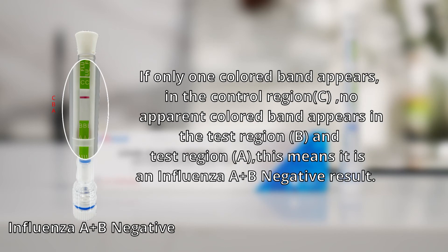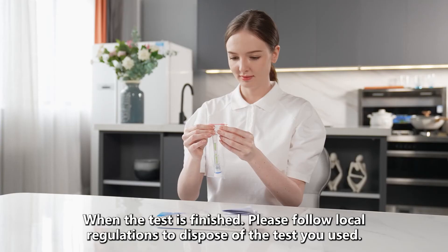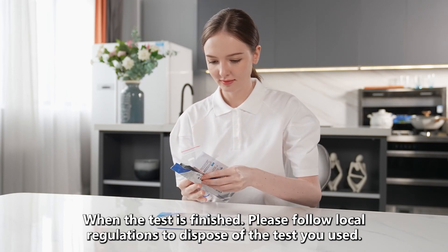If only one colored band appears in the control region C with no apparent colored band in test regions A or B, this means an influenza A-B negative result. If the control band fails to appear, it means an influenza A-B invalid result. When the test is finished, please follow local regulations to dispose of the used test.